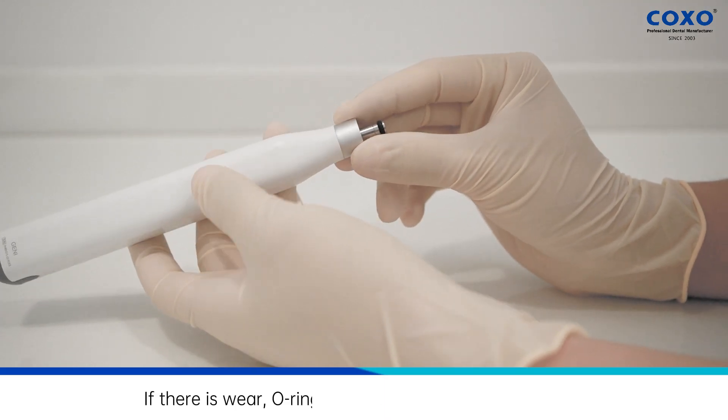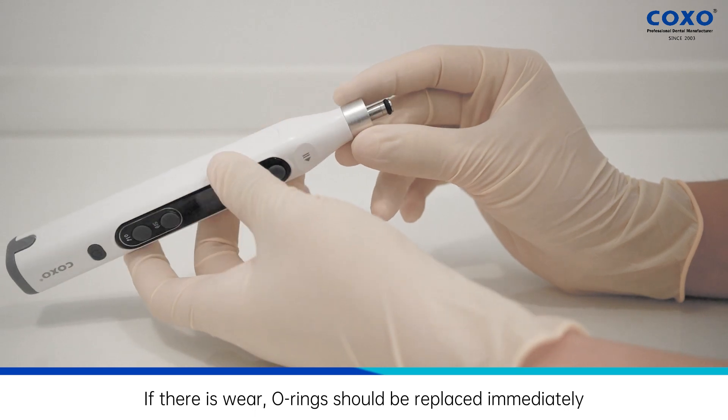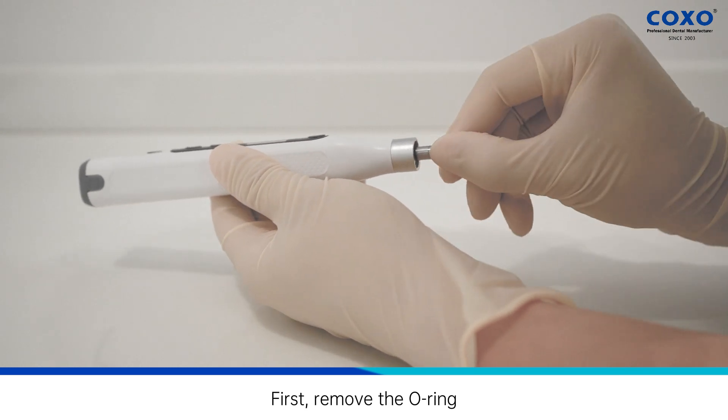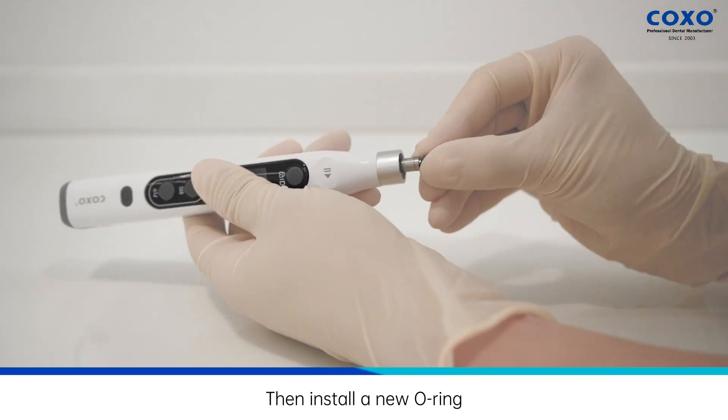Check o-rings for signs of wear. If there is wear, o-rings should be replaced immediately. First, remove the o-ring. Then install a new o-ring.